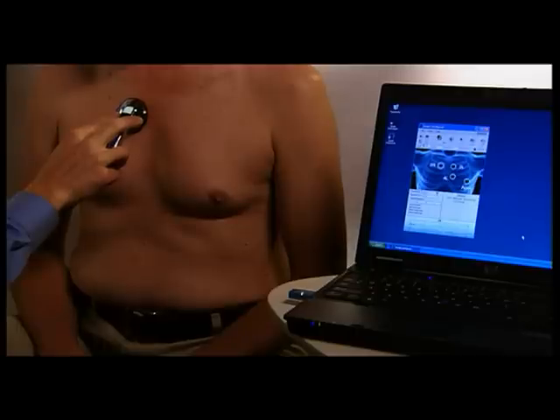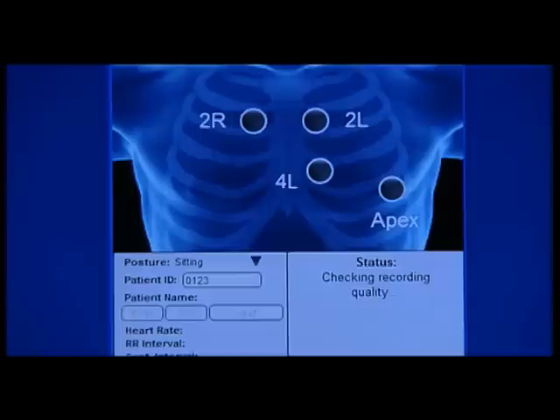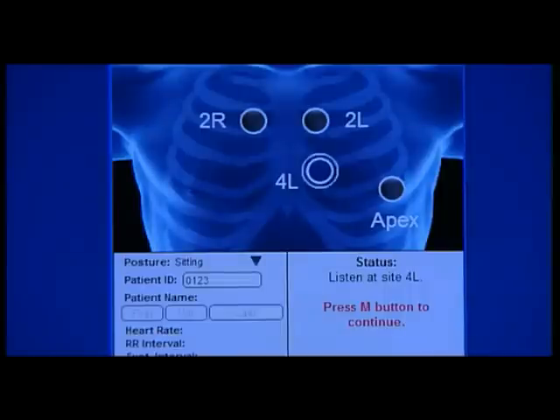Twenty seconds are needed for each recording. The second recording site is 2L, or pulmonic site. The third recording site is 4L, the left lateral sternal border, or tricuspid site. And the fourth recording site is at the apex, or mitral, site. Follow the Zargis CardioScan software voice prompts heard from the ear tips of the Littmann Model 3200 stethoscope.